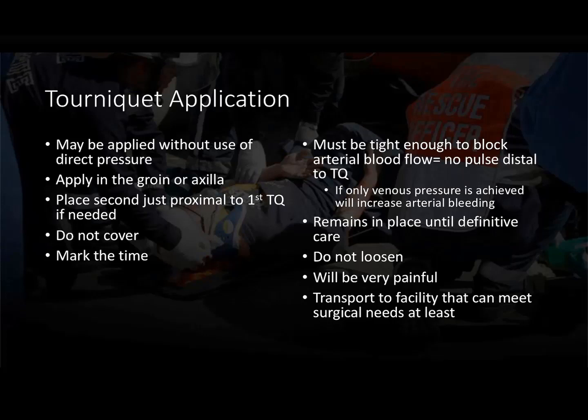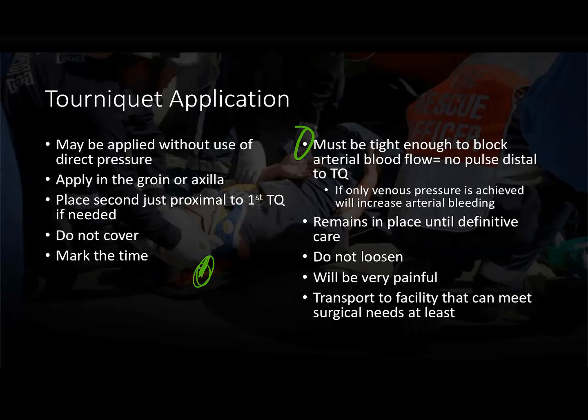When we apply a tourniquet, you need to document and create a piece of tape that has the time and your initials as to when that tourniquet was applied. You can put that directly over the windlass on the tourniquet so it's readily available to anybody who accesses that tourniquet and assesses it. When we apply the tourniquet, it's important that we not only stop bleeding, but we need to cease all blood flow to the patient's extremity, including distal pulses should be absent after the tourniquet has been applied and bleeding controlled. Now, why is that? I think it's worth a small discussion.